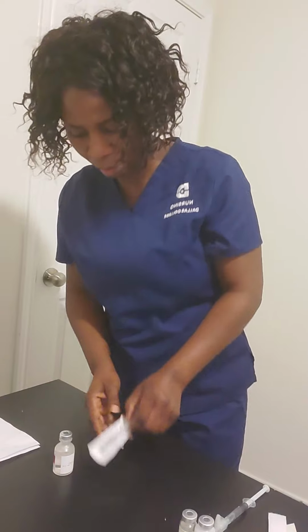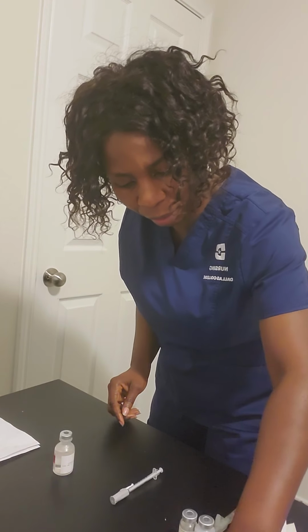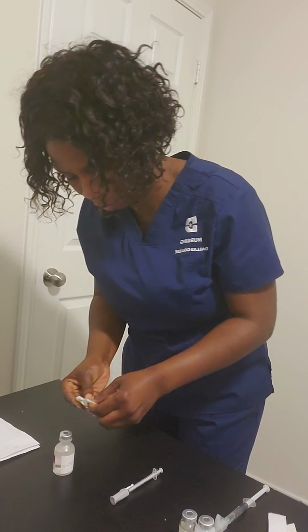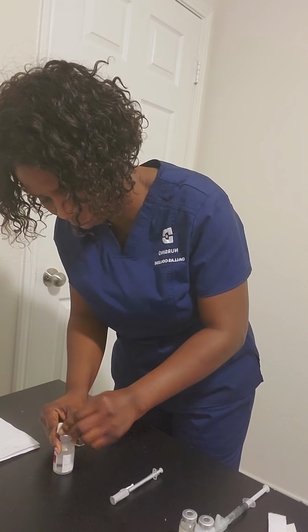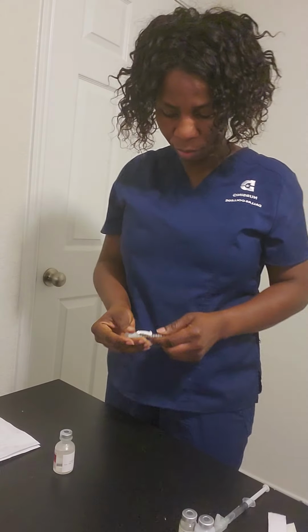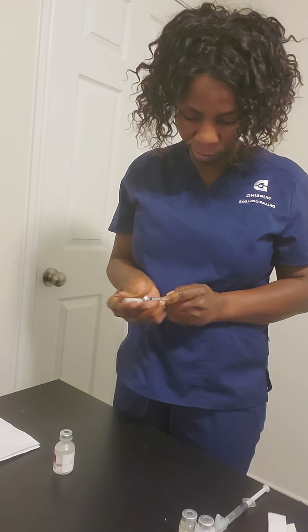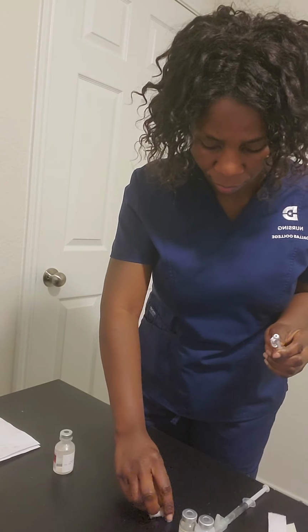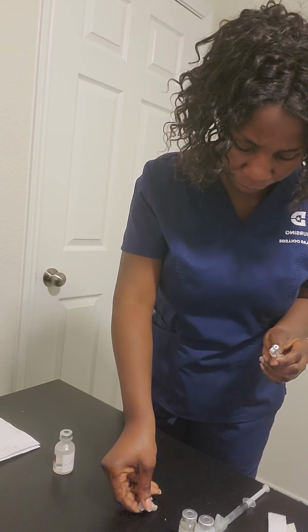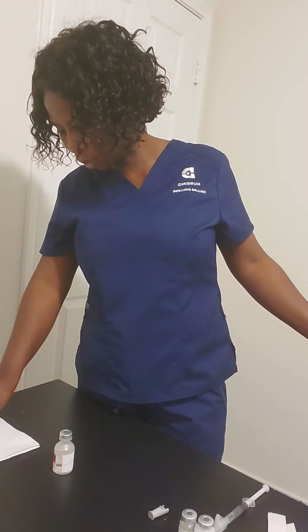The next thing is to draw my PPD. I'm going to clean with an alcohol pad again. Then I'm going to take off the cap carefully. Going by instruction, it says PPD should be 0.1 ml.